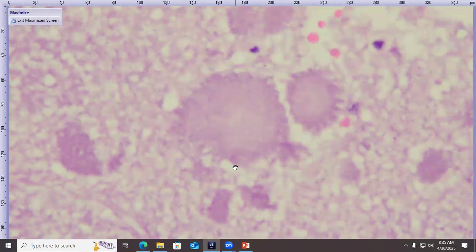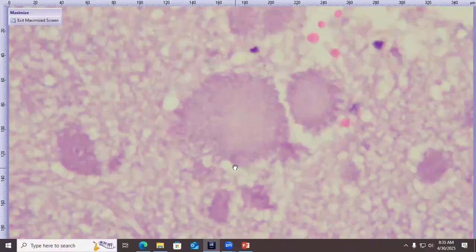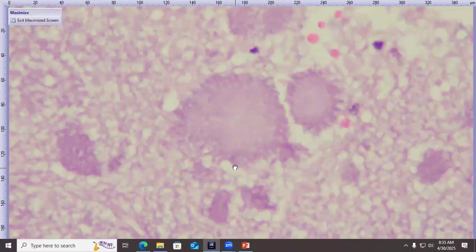These are these lovely little pom-pom looking dudes. They have a sort of filamentous look, kind of clustered multifocally admixed with the exudates inside this abscess. Possibly if you saw these on a gross unfixed specimen, they would present as like a sulfur granule type thing. Basically just clusters of bacteria, maybe plus or minus a biofilm, some matrix that they're making. They look kind of filamentous on H&E, although maybe not so much on this image. It's hard for me to get them in focus right now.